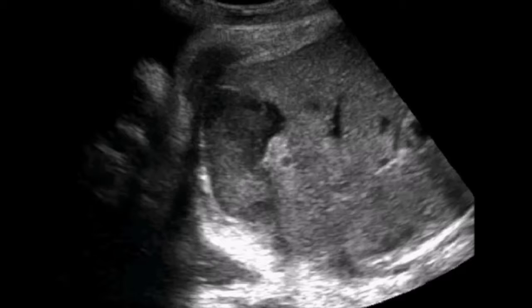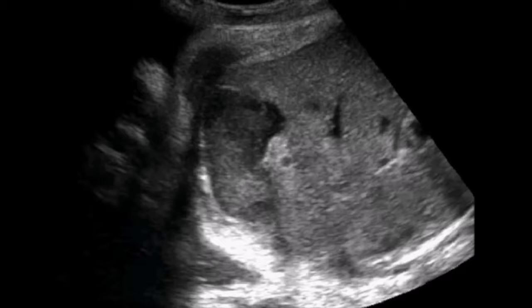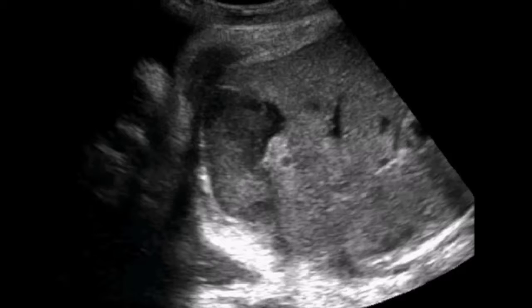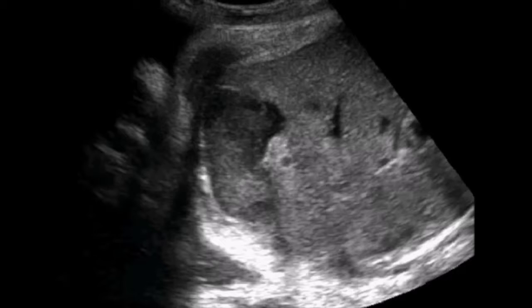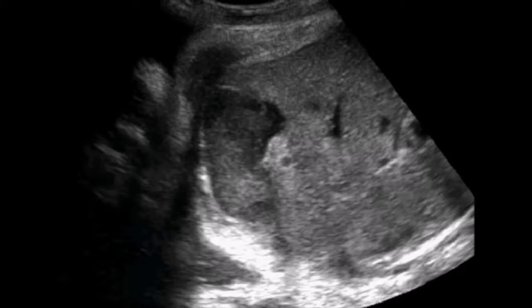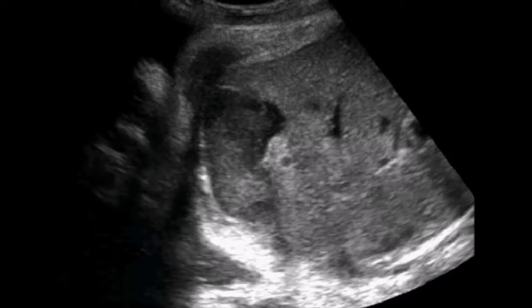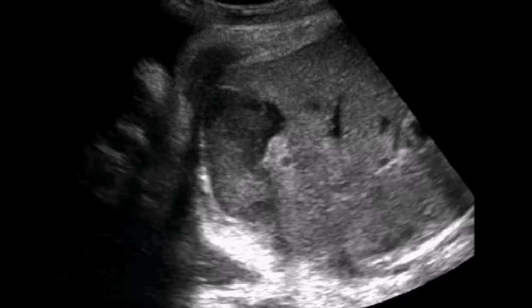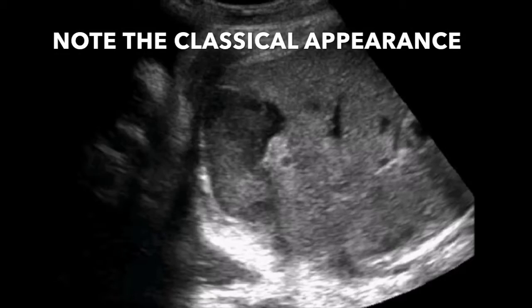So whenever in obstetric ultrasound you see any abnormal dilatation of the bowel loops, one should always look for the diameter of the bowel loop dilatation, the thickening of the wall if any, and the internal echoes inside.